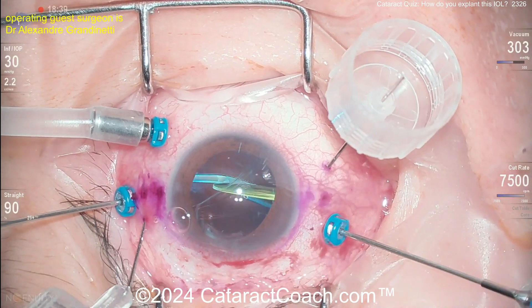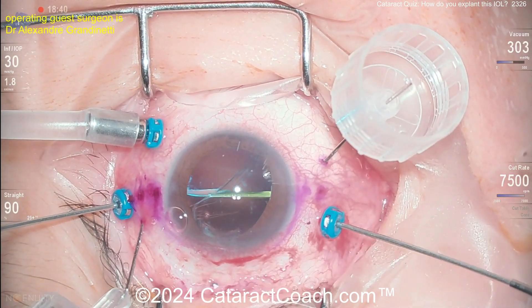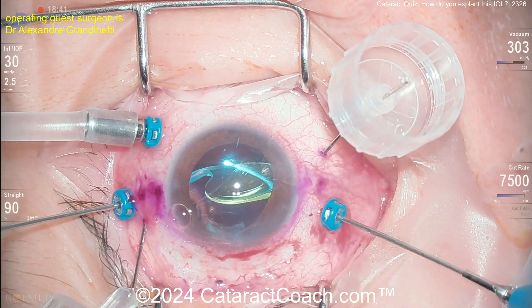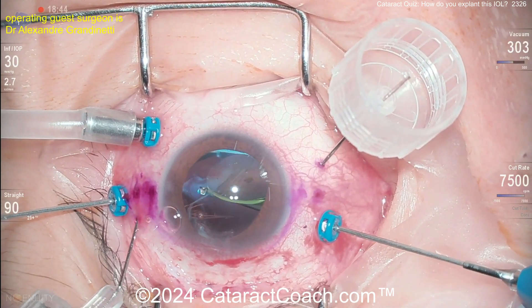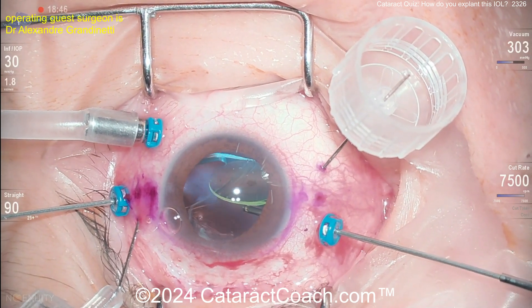A pars plana vitrectomy is being done here, which is good — clean up all that vitreous that's entangling around this lens. Make sure it doesn't fall back into the vitreous cavity. Now, how are you going to explant it?